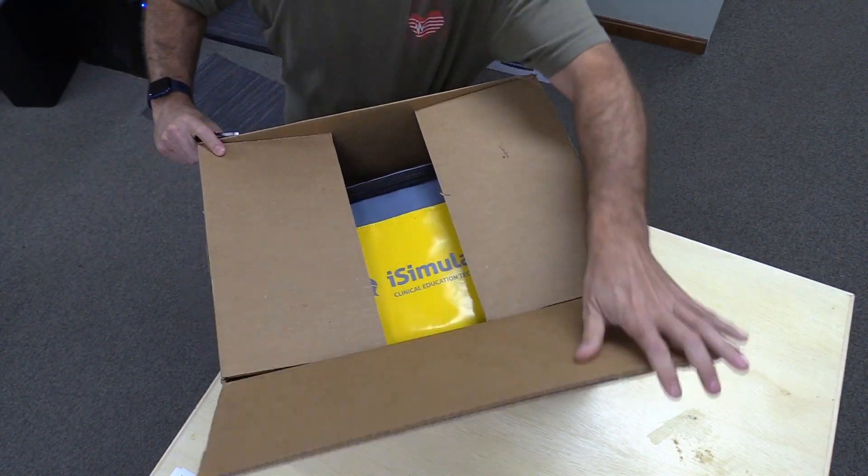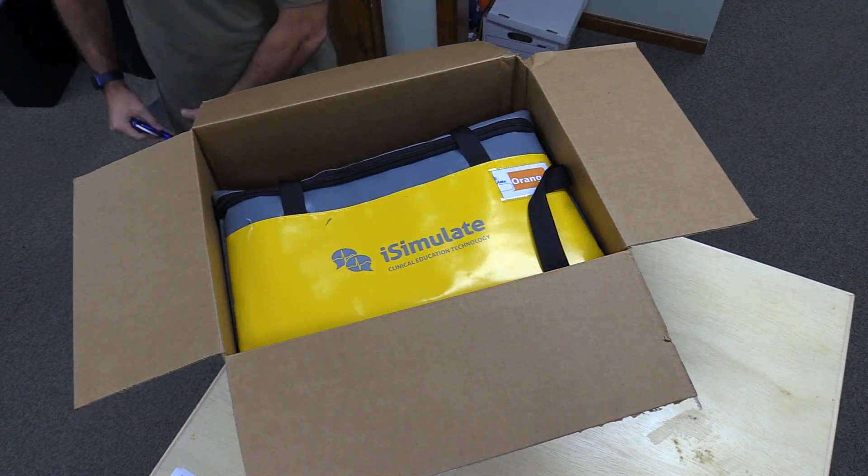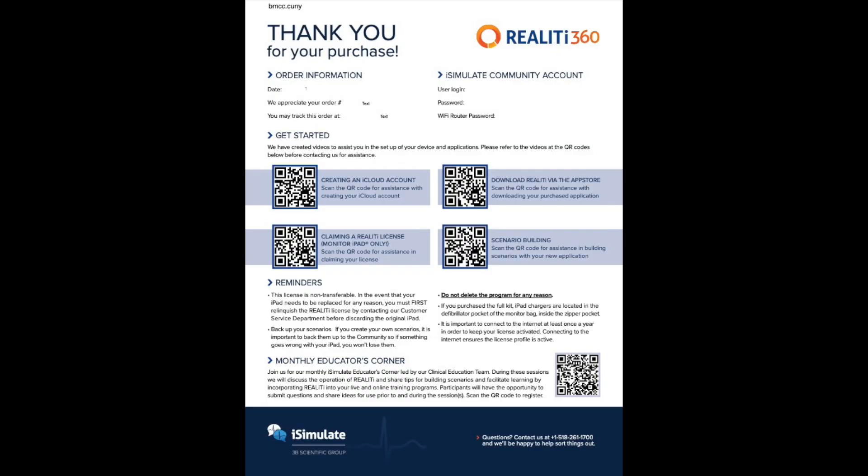While you're getting ready and getting things out, please make sure you locate your welcome letter, which was emailed to you by your sales rep or our shipping team. This is going to have important information for use later in this process.